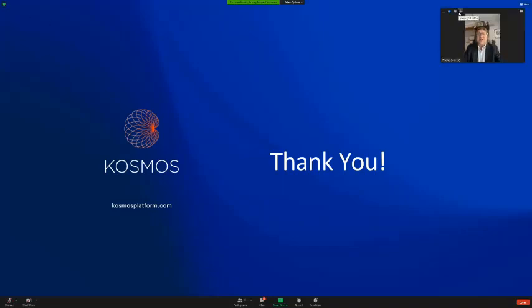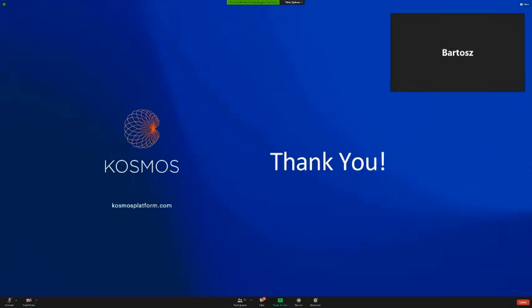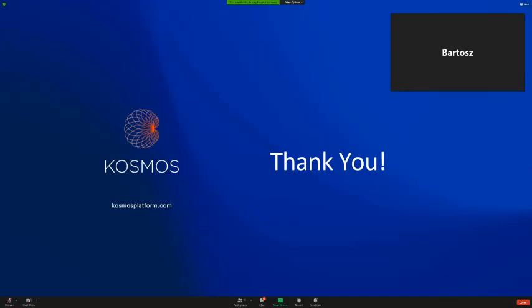Are there any questions? We are recording the whole session, so Bartosz, how is it going? I think that hopefully we will be able to provide all the doctors this recording. Yes, if there are any questions that anybody would like to raise, please do. We have one last simple real-time demo. Okay, so I have a question. Yeah, go ahead.